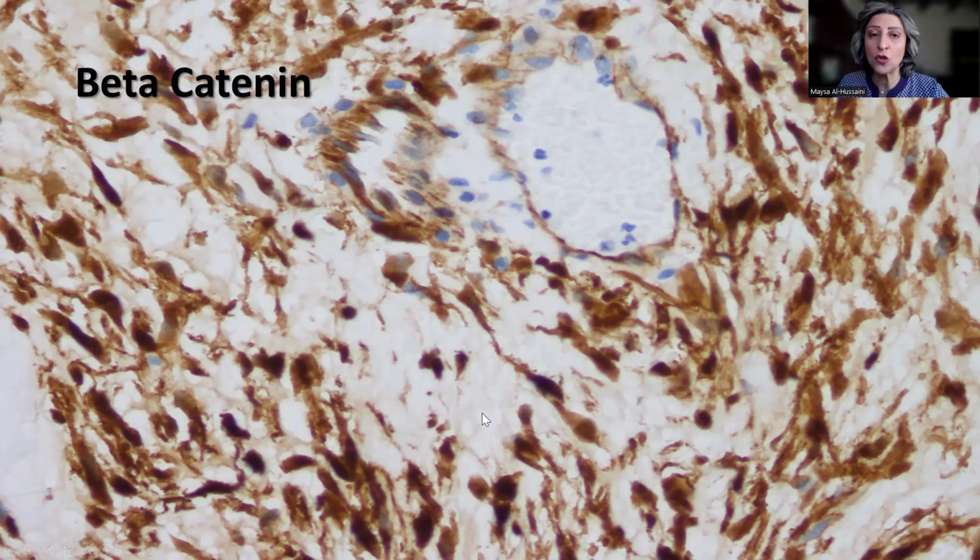This is the way I interpret beta-catenin. Again, negative internal control. This is really the usual staining pattern. This is the nuclear staining that we interpret whenever we want to say that beta-catenin is positive. And the way I report it is positive in nuclear stain, between brackets, mutant. If there wasn't a nuclear stain, I would say a positive stain in the membrane and the cytoplasm, between brackets, non-mutant, no nuclear stain, just to make it clear to other pathologists reading the pathology report or to our physician colleagues.